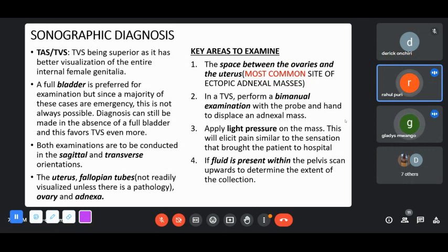I was able, at least the second year guided me. All right. So how were they able to get that? What he told me is to just apply more pressure, and when I did, at least I was able to get the head circumference and see that the lie was cephalic.